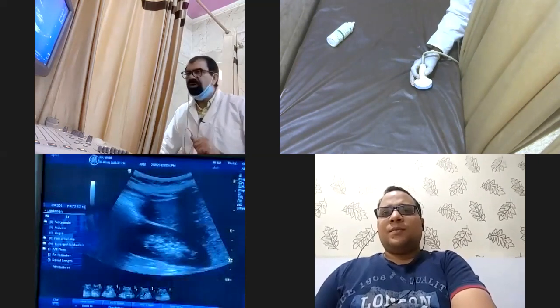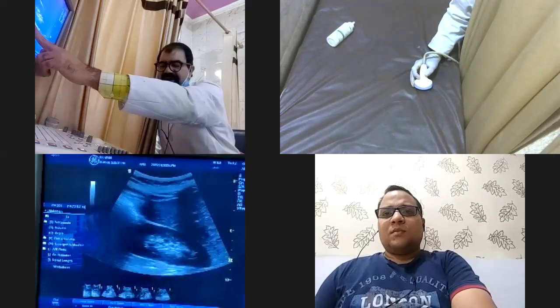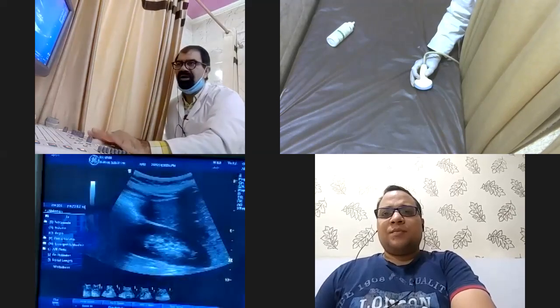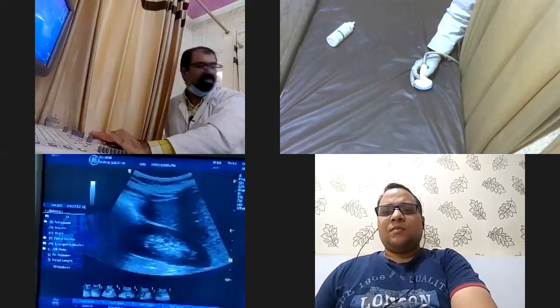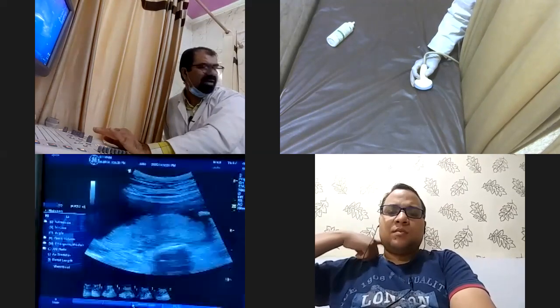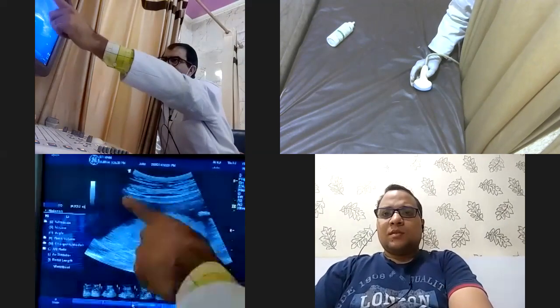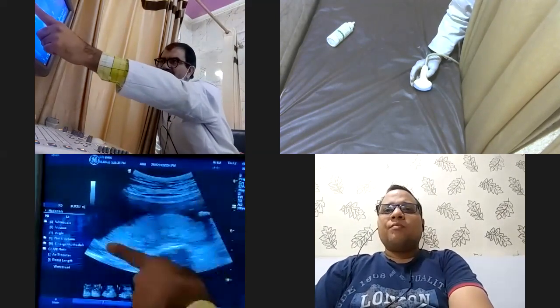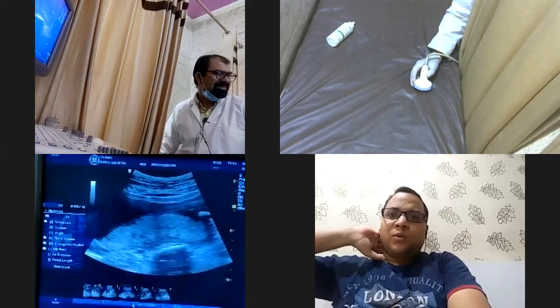Now, this is anterior and this is posterior. You know that now, na? Now, I told you just some minutes before that this is the placenta. Now tell me whether this is anterior placenta or posterior placenta. Sir, posterior placenta.